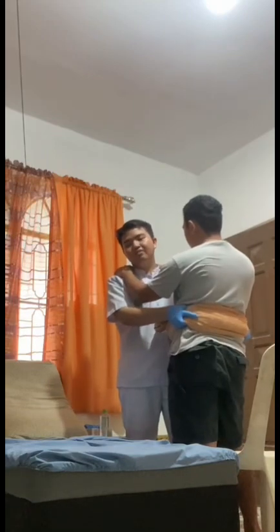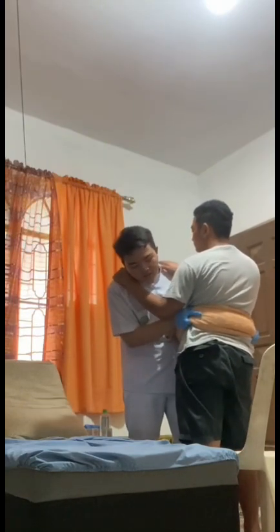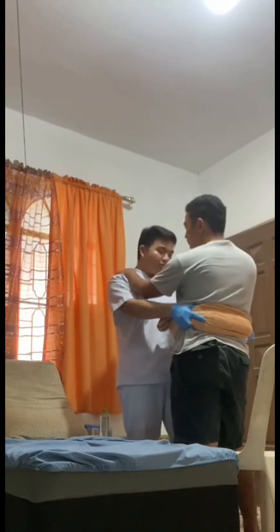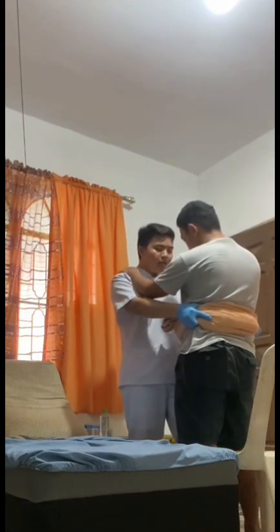Now that the patient is already standing, I will assist the patient in going to the center of the chair. 1, 2, 3. Before sitting the patient, I have to make sure that the patient is in the center of the chair. And now that the patient is already in the center of the chair, sir, we are now going to sit together, nice and slow, on the count of 3. 1, 2, 3.